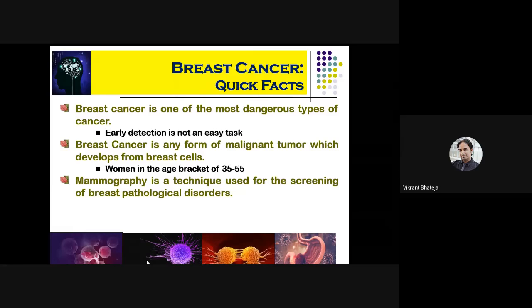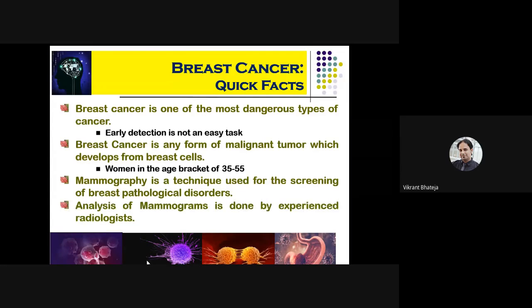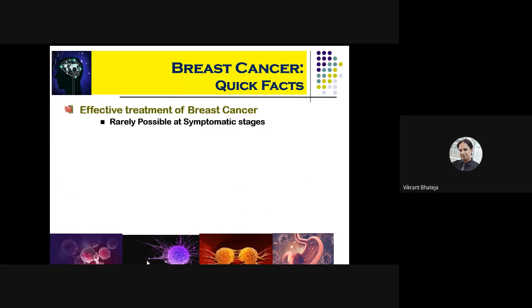If you want to screen for this particular cancer in the breast region, mammography is the very basic or fundamental technique which is used for screening of such breast pathological disorders. But the challenge is that the analysis of these mammograms, that is the outcome of this mammography technique, the X-ray of the breast region, is done by an experienced radiologist.